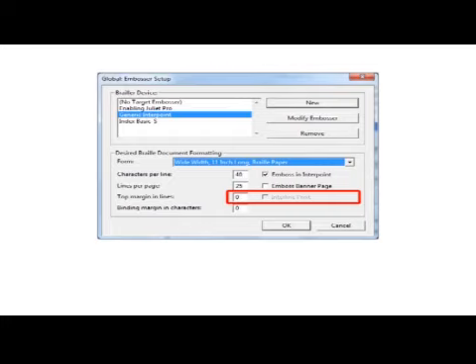If you are satisfied with your changes, press the OK button. If you wish to abort this process and return to DBT, press the Cancel button. Please note that pressing OK in this main dialog not only confirms any changes made to this dialog, but also any changes made to the general device settings and advanced dialogs. Take special care to ensure that you have highlighted the Brailler device which you wish to be your default for any new documents created.